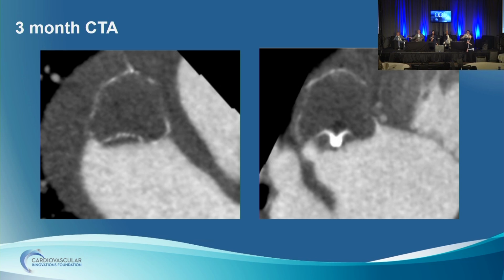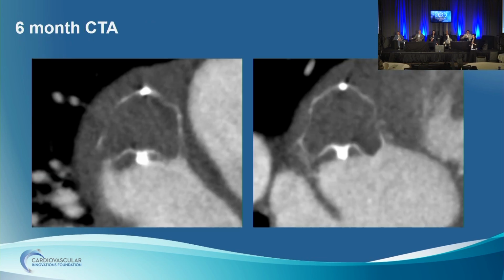Okay. So we decided to continue on the Eliquis medication. She was tolerating it. What would be the interval imaging that you would do for this, if any? Another 3 months. Another 3 months? You would push it a little bit, okay. So we decided to do a 6-month CTA, and we just got this imaging, and now we see this. So she's on full dose Eliquis still. What should we do? We just got this imaging back.